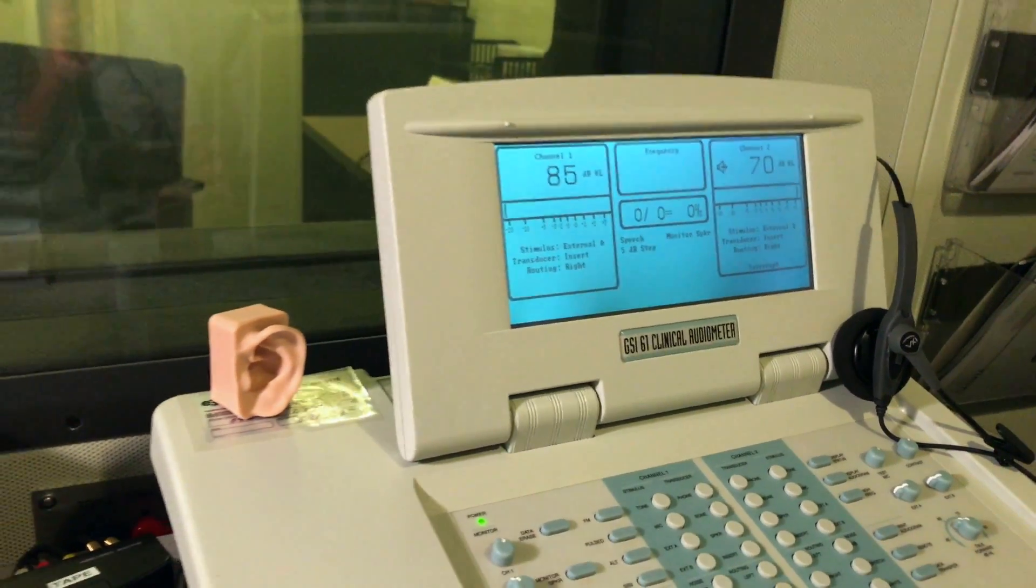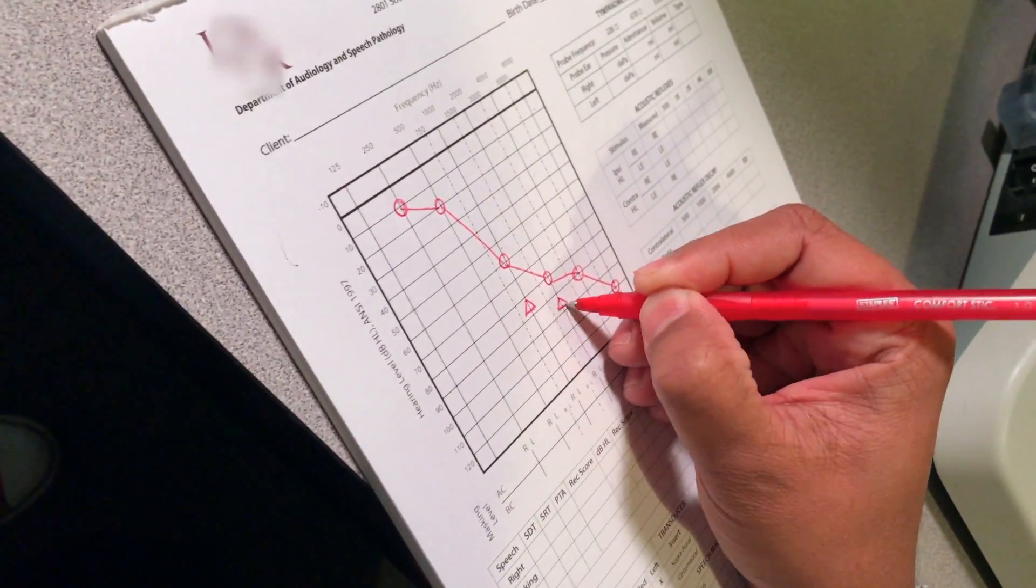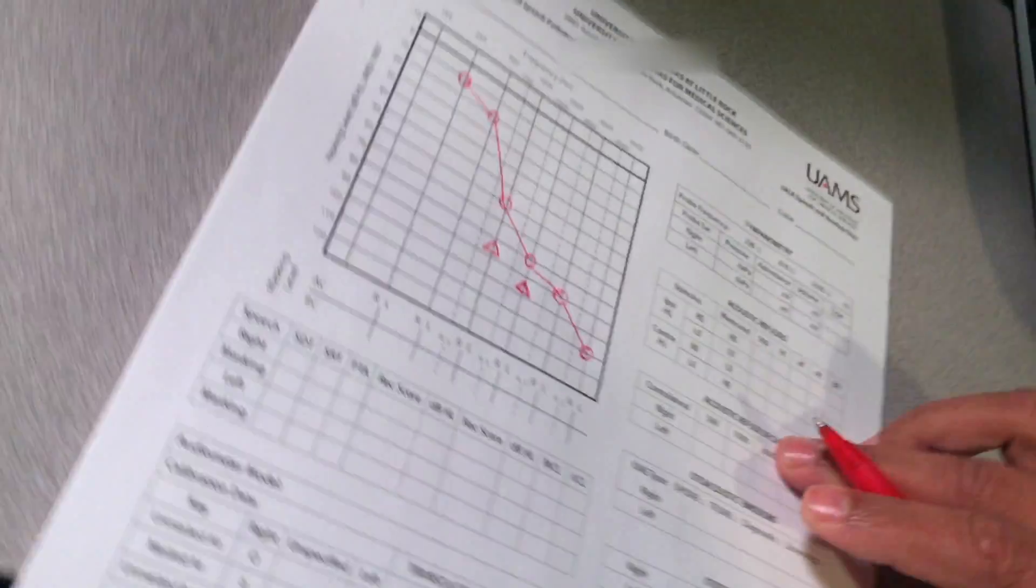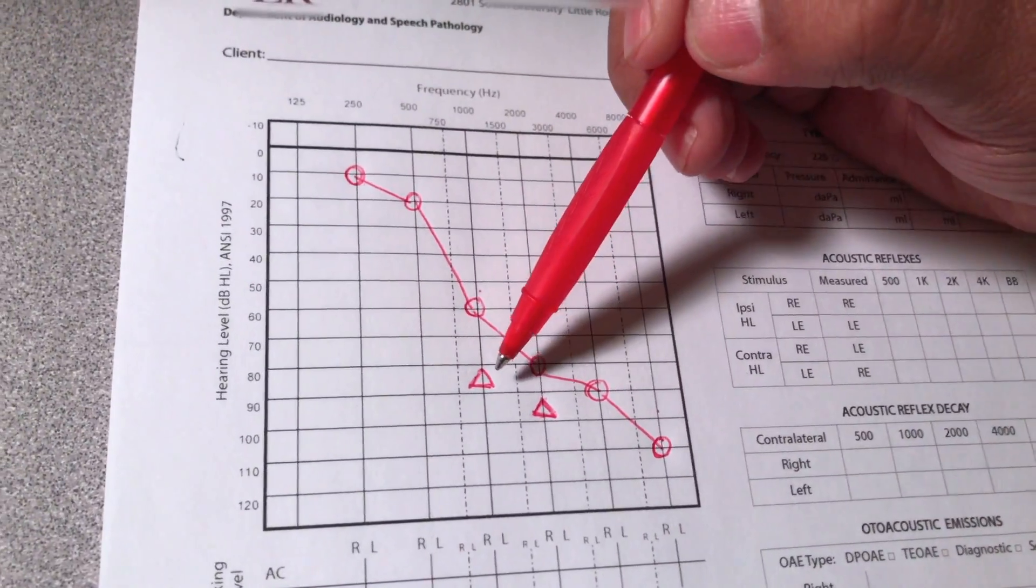Let's just assume that the person's new threshold now is 85 dB. Mark that on your audiogram. That's how you measure TEN test threshold.